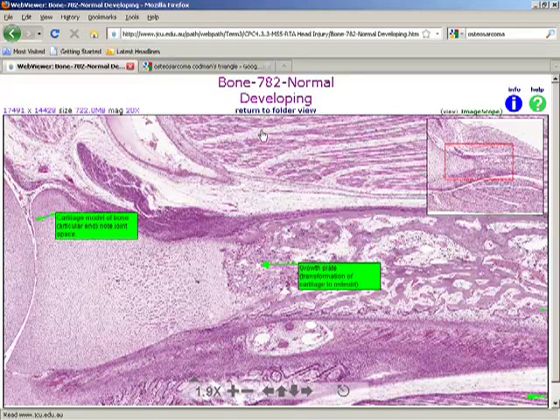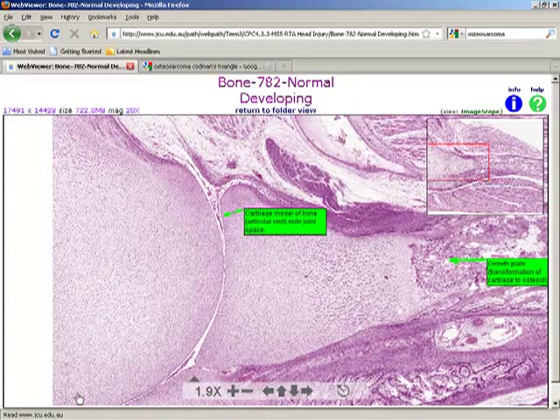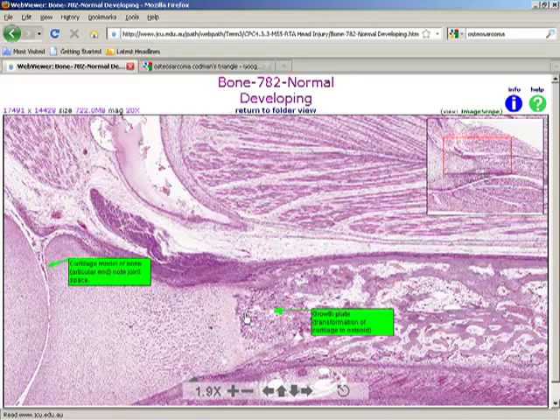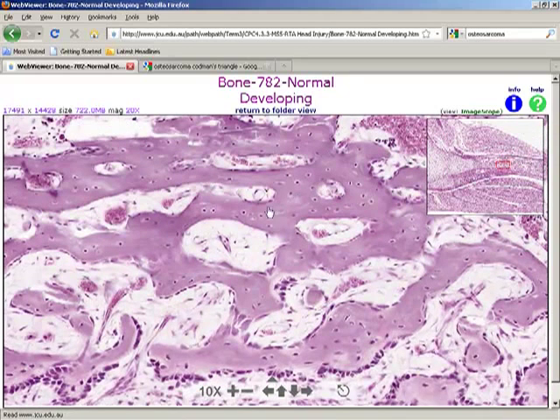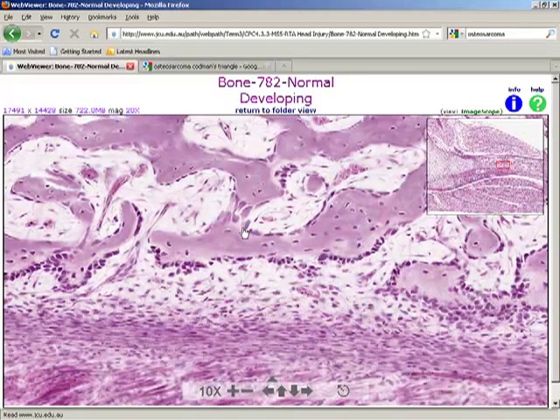See that? That's the muscle there. This is the tibia. That's the lower end of femur, and that's the growth plate. So growth plate is nothing but area where there is dissolution of cartilage replaced by osteoid tissue. Now this type of osteoid you will see in fractures. Irregular, no fine lines, lamellae are not formed, and marked prominent osteoblasts lining them.